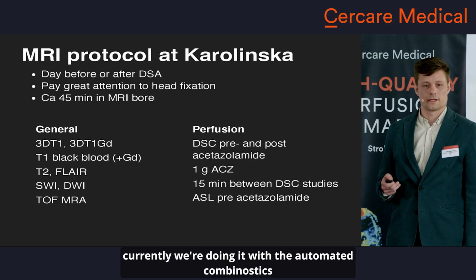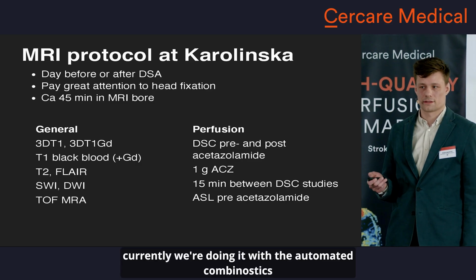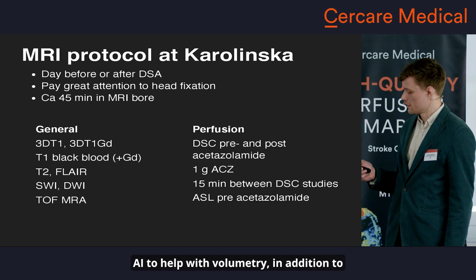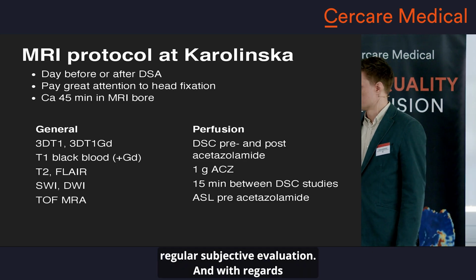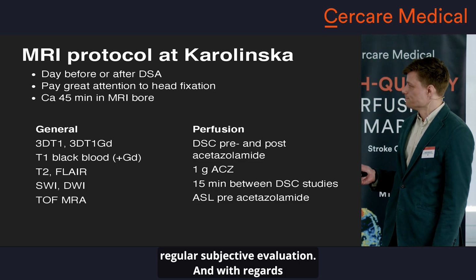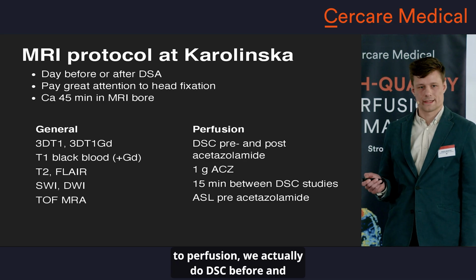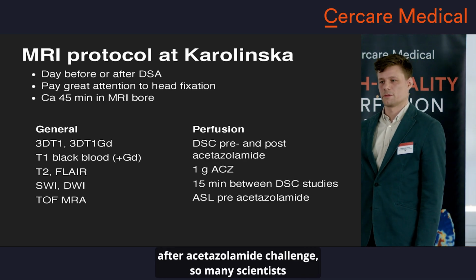Currently, we're doing it with the automated Combinostics AI to help with volumetry, in addition to regular subjective evaluation. And with regards to perfusion, we actually do DSC before and after acetazolamide challenge.